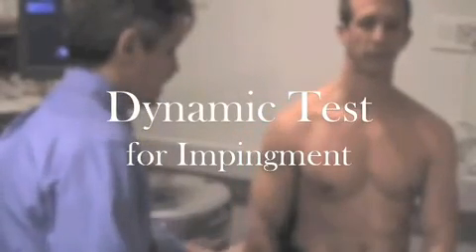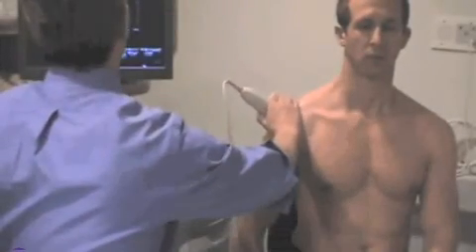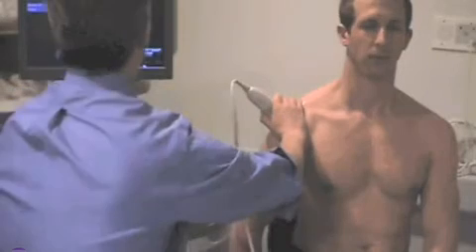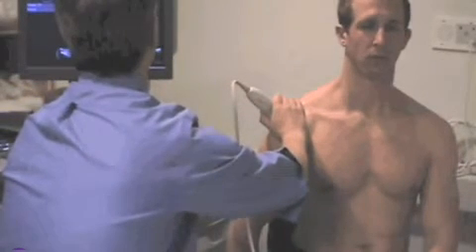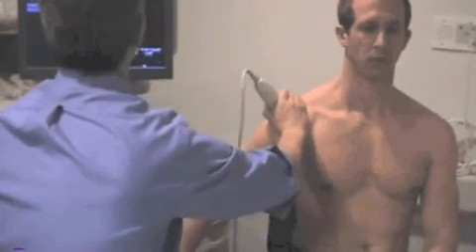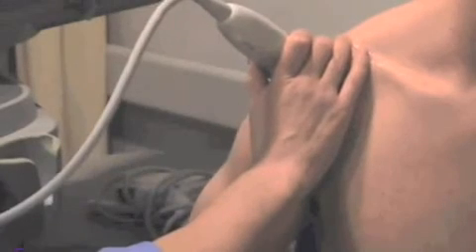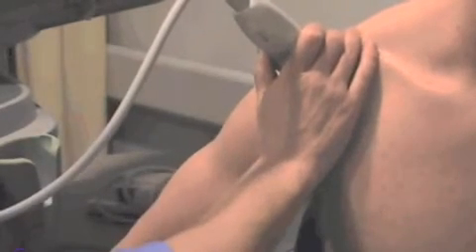Ultrasound can also be used to test dynamically for impingement. The probe is placed on the lateral aspect of the acromion. The examiner can then grasp the patient's arm at the wrist and abduct in order to demonstrate the rotator cuff gliding underneath the acromion. This close-up view again shows abduction and adduction of the shoulder. On the ultrasound view, we can see the supraspinatus tendon gliding underneath the acromion.